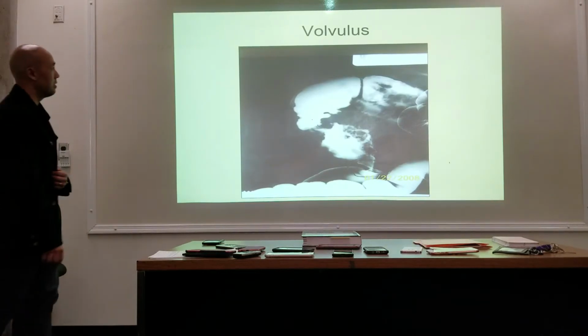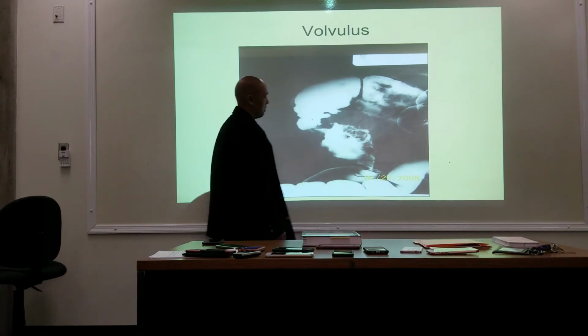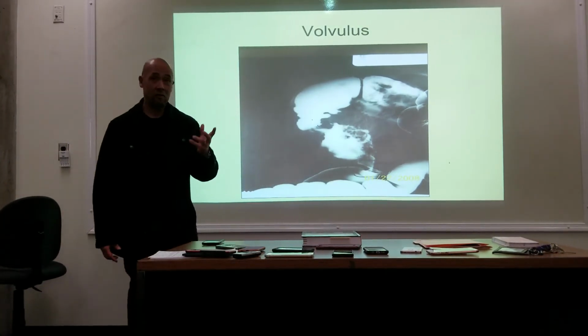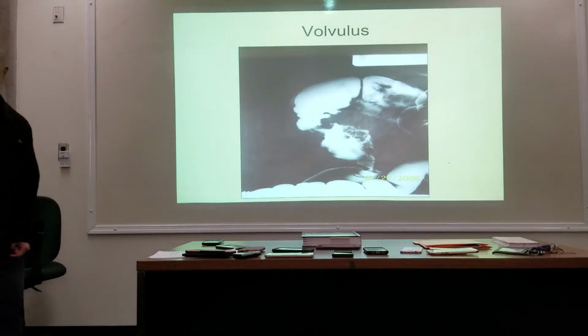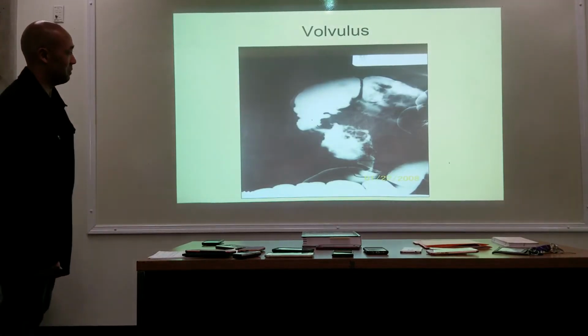Okay, here's another volvulus, right? Actually, two of them. And so the doctor would have to determine, is it a volvulus or is it actually a neoplasm? So the doctor will have to determine that.